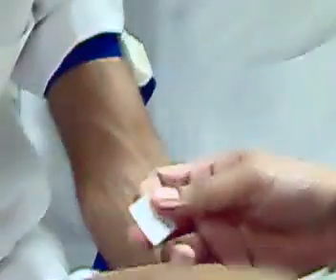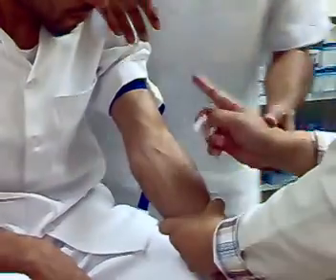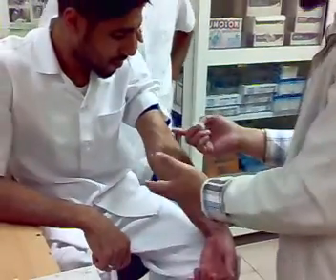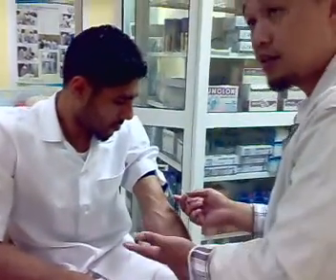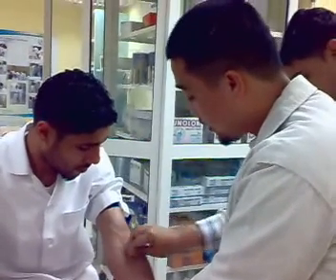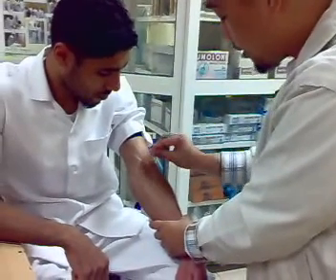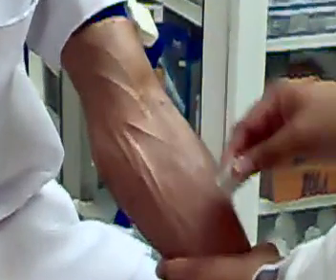If the patient is black, for example, you will not be able to see the vein correctly and clearly. So what you will do is to palpate if you cannot see it. But this vein is clear. So the proper way of cleaning it with alcohol is to start from the middle and to the side.